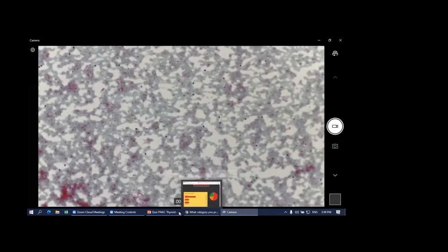Okay. So, let's look into the slide further. Let's not go too fast. First of all, this next case. I forgot to tell you guys the history already. This is actually a 39-year-old female. Cellularity wise is actually not that great. I'll show you the marked area.